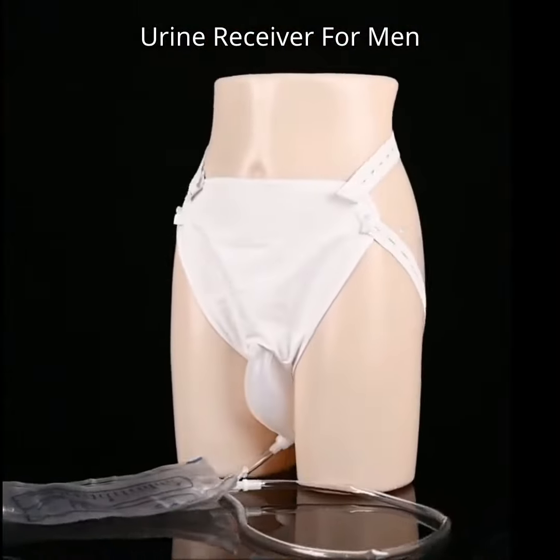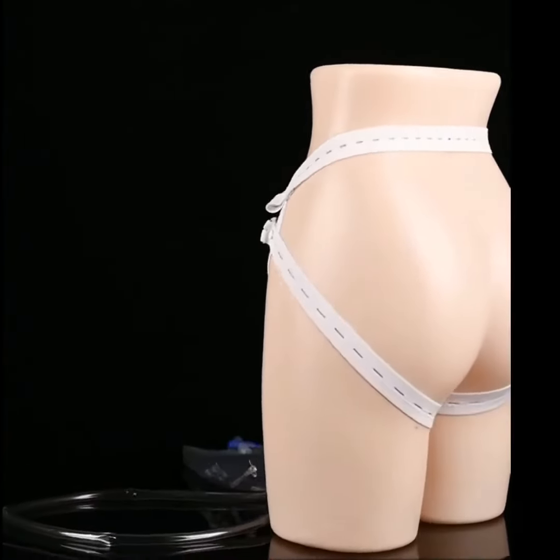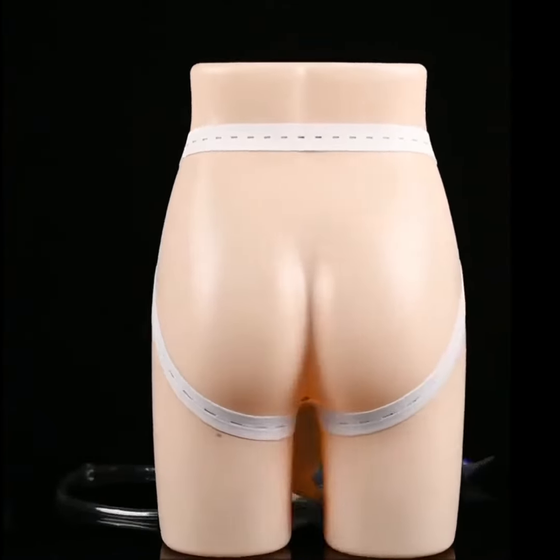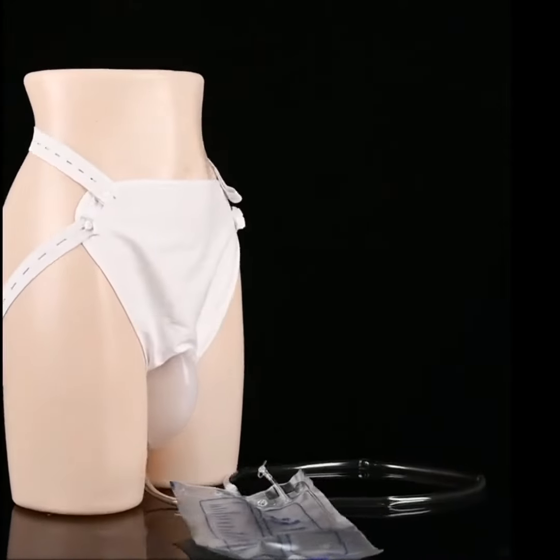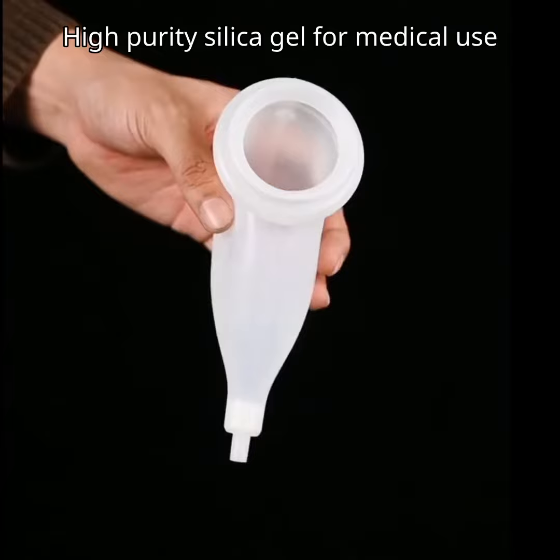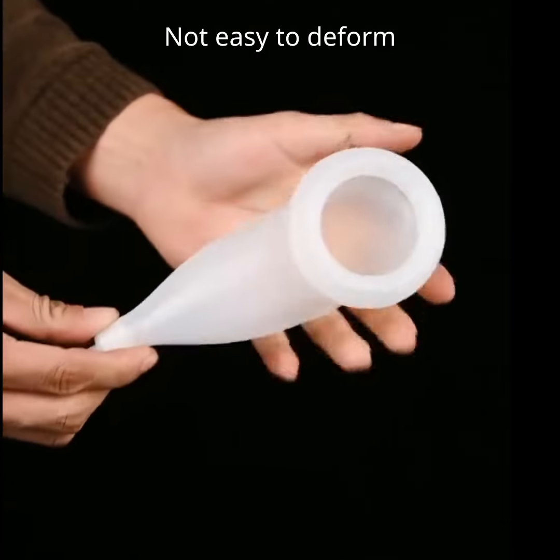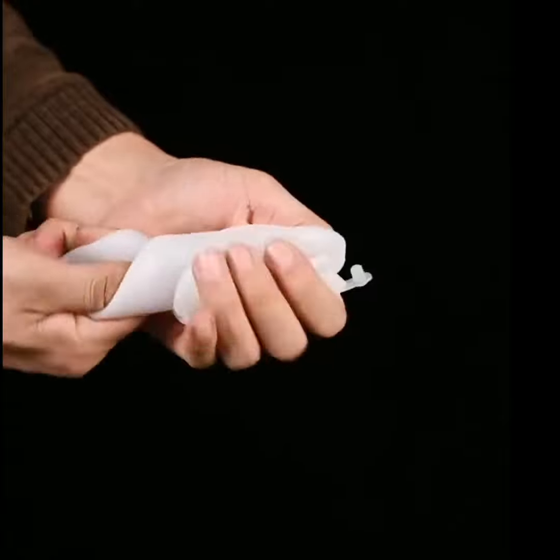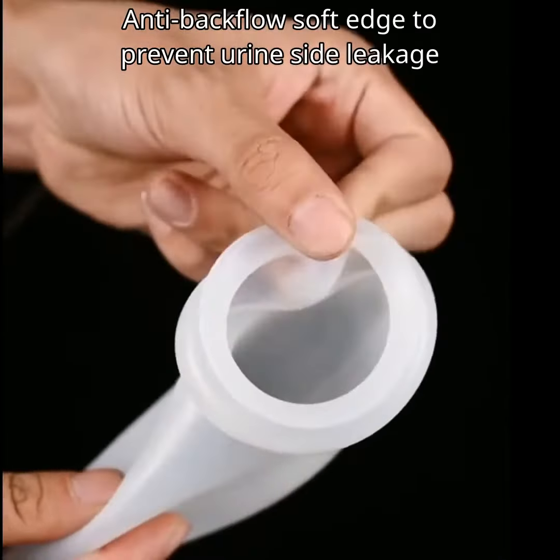Urine receiver for men. High purity silica gel for medical use, bend at will. Not easy to deform. Anti-backflow soft edge to prevent urine side leakage.